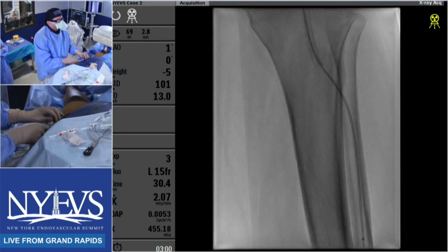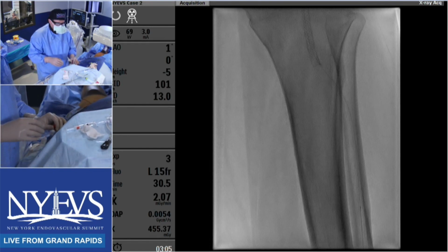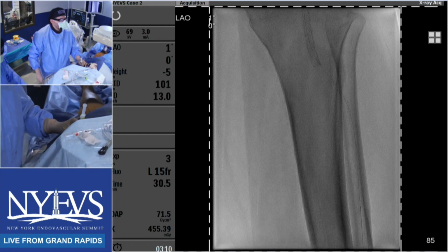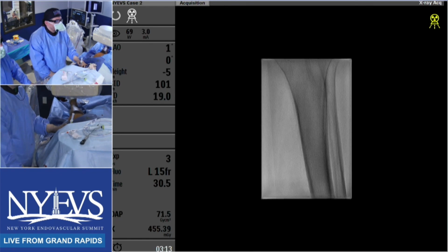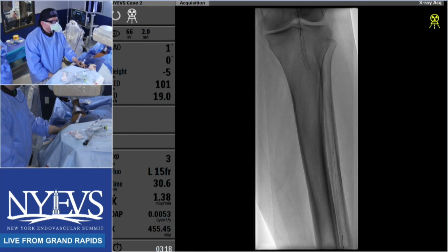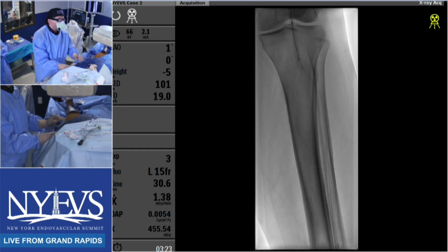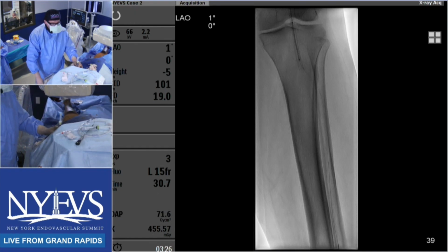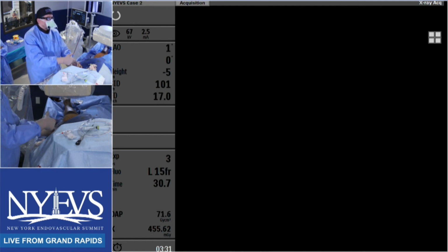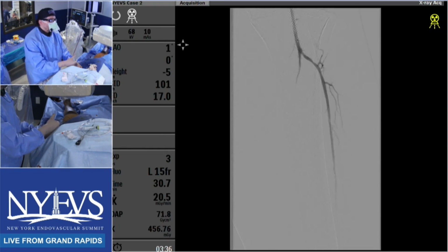So this is a patient that if they don't heal, you would consider DVA in the future. Based on what we've done today, we're treating the SFA popliteal. I'll probably treat the AT off camera today, but with the partial pedal loop reconstruction, I'm hopeful that we don't need to do that. I would not like to do that unless I absolutely need to because of the patient's age and comorbidities. But I will put in my note that I suspect there's an interruption in the pedal loop.